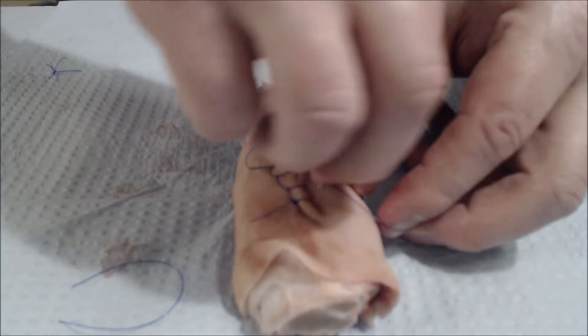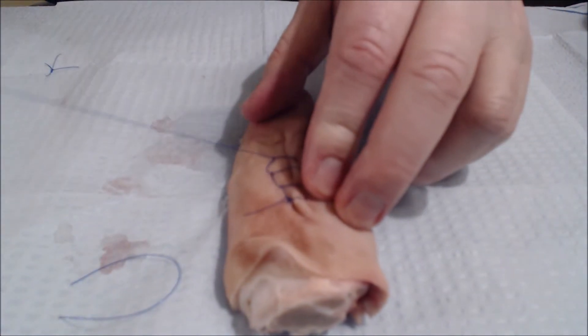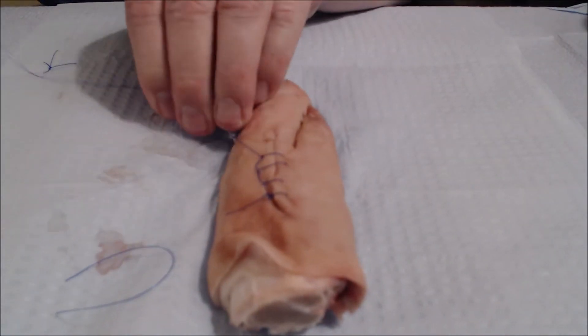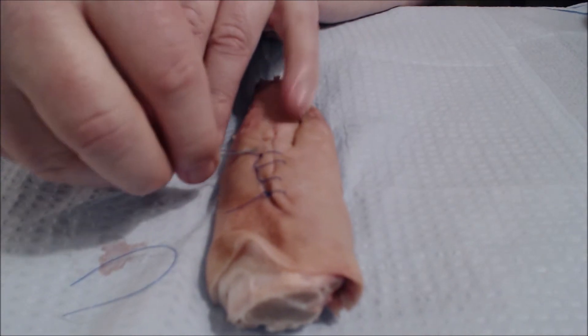This locking suture is used to keep the area from bleeding and to keep it watertight.